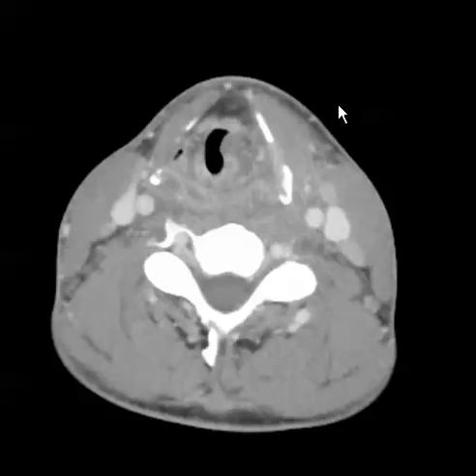This is an axial CT image through the level of the neck after the use of intravenous contrast on a 23-year-old male with neck pain and swelling.